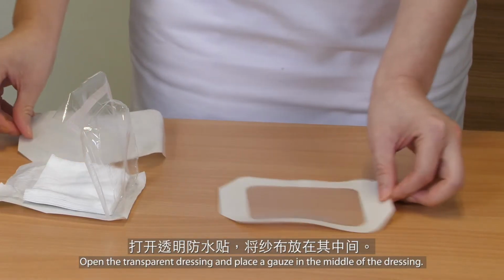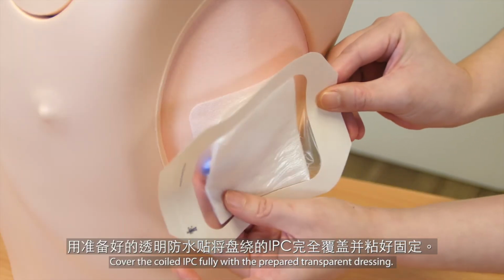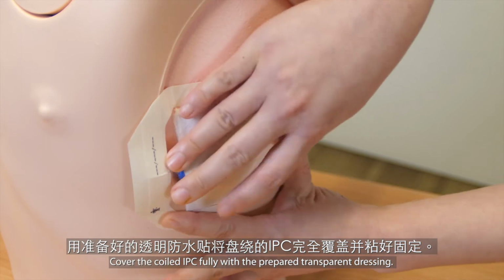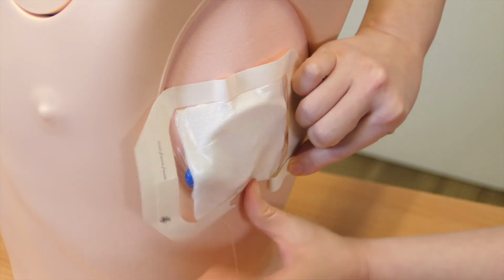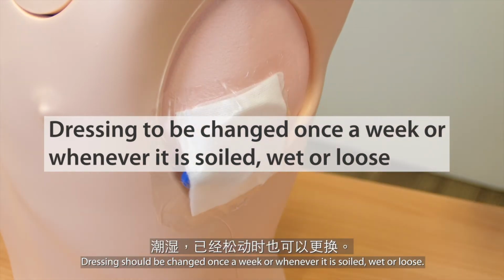Open the transparent dressing and place a gauze in the middle of the dressing. Cover the coiled IPC fully with the prepared transparent dressing. Dressing should be changed once a week or whenever it is soiled, wet or loose.